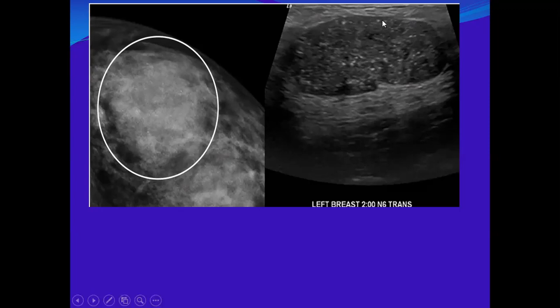I can see the mass is mostly circumscribed. But I agree with you, the mass is studded throughout with microcalcifications, and there are tiny cystic changes. So I can put phylloides as a differential. There is no posterior shadowing. There are indifferent posterior acoustic features, but only edge shadowing. The edge shadowing obscures the medial and lateral aspects of the mass.